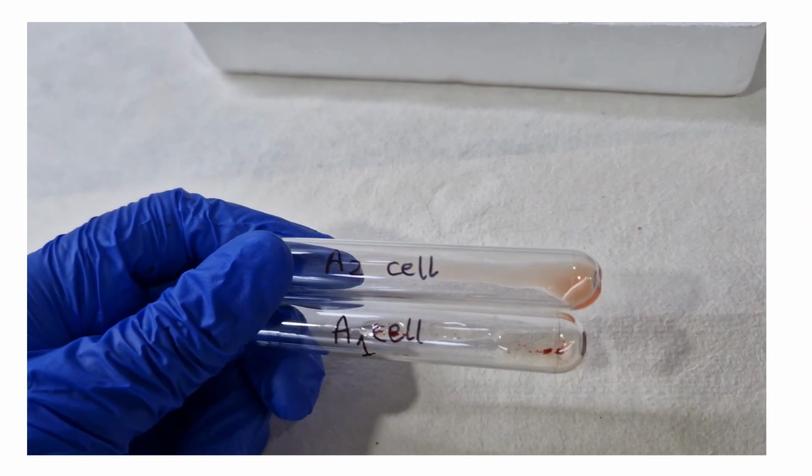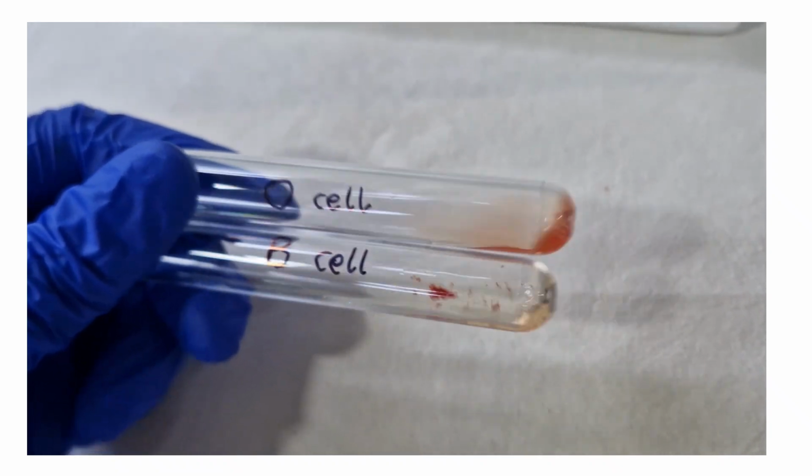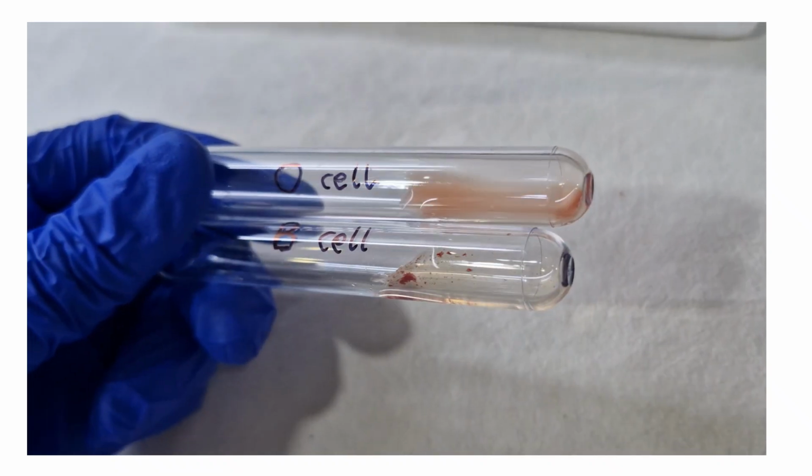Coming to the results of reverse grouping, in A1 cell there is a 2 plus reaction. In A2 cell there is no agglutination reaction. In B cell there is a 3 plus reaction, whereas in O cell there is no agglutination reaction.